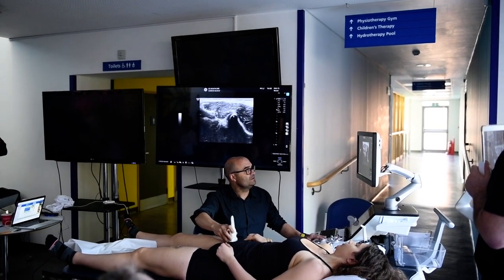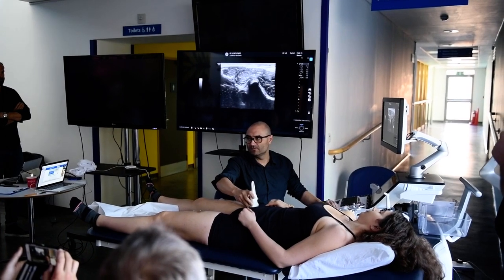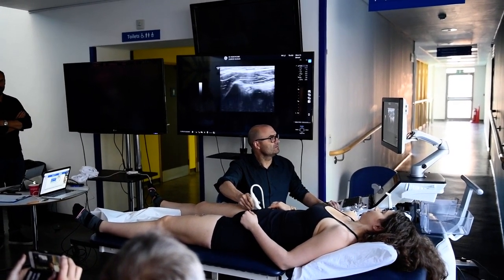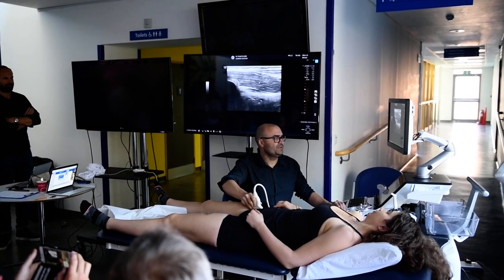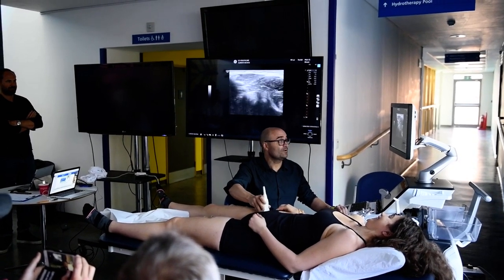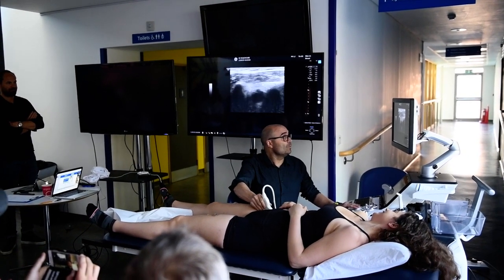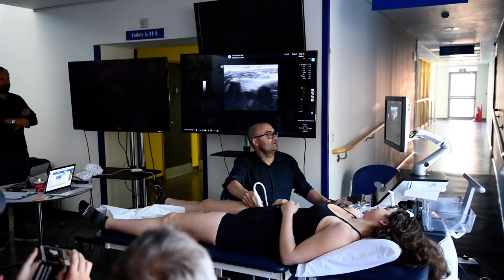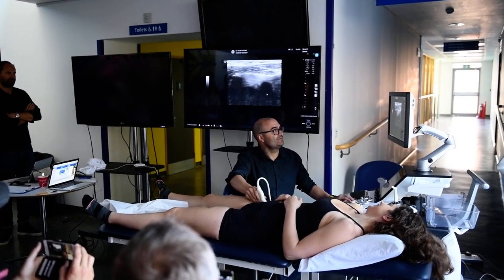We're moving up and we see the anterior inferior iliac spine with this hand. We run the probe. We've got another injury here. We rotate the probe in longitudinal axis. We can assess here the direct tendon, and here the shadow of the indirect tendon.